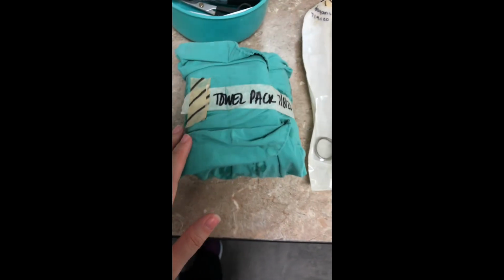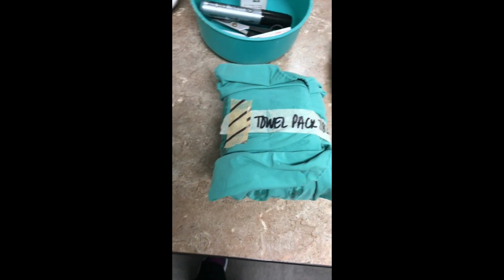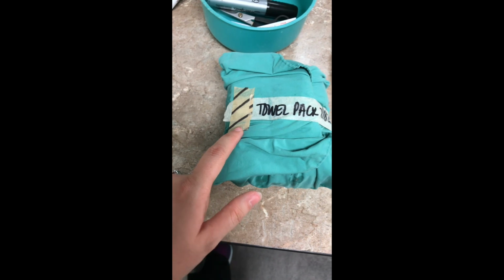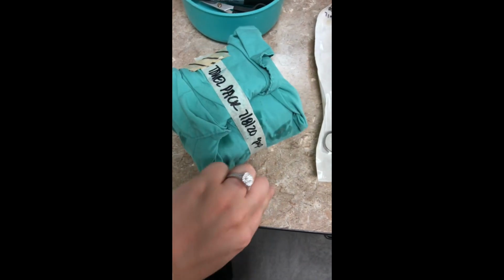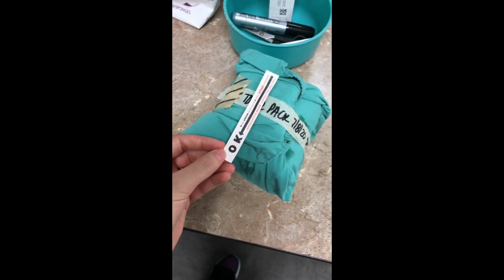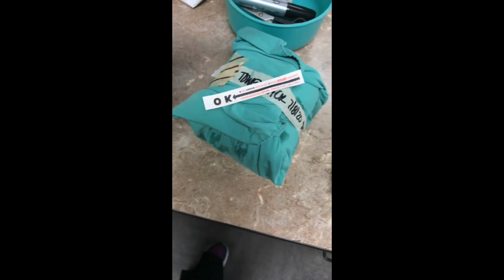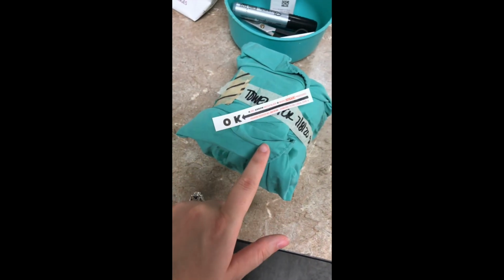So after your packs have been autoclaved, there's a couple ways to tell that they are sterilized. I'll show you on this pack that just came out of the autoclave. We have our indicator tape that starts out with white strips. When it is up to temperature and sterilized, they turn black. Also, whenever you open it, there will be an indicator strip inside as well, that starts out looking like this, and once it is sterilized up to temp, it turns black.